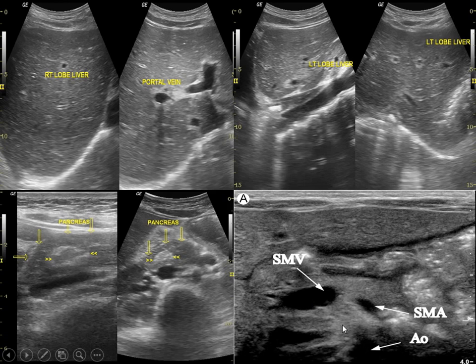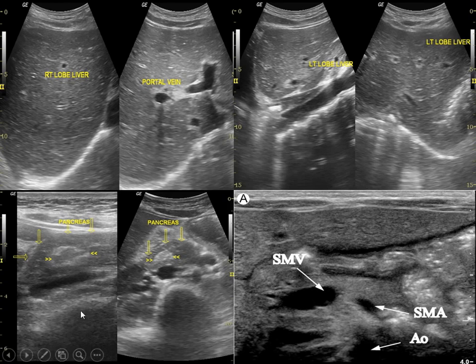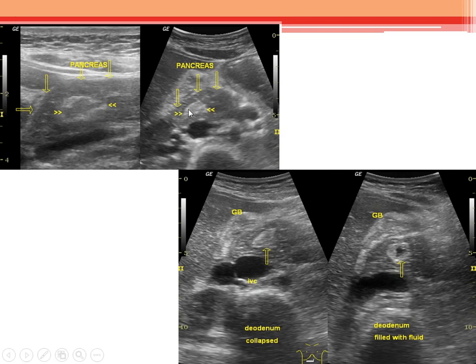Is the SMV/SMA relationship normal or abnormal? Raise your hand for normal. Definitely, you should be confident — this is normal. The SMV should be to the right of the SMA. If it's anterior or to the left, that indicates malrotation depending on the degrees. So we excluded malrotation safely with ultrasound. But we saw something concerning: something echogenic inside the pancreas.